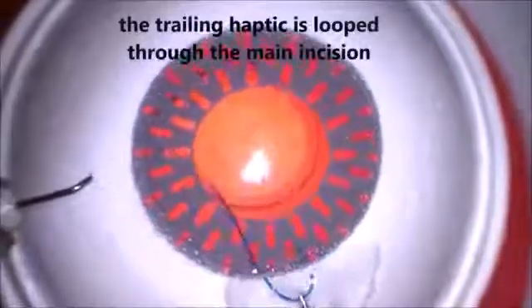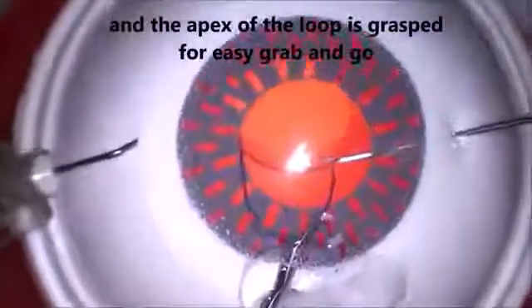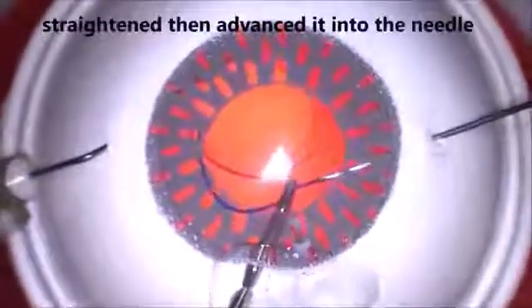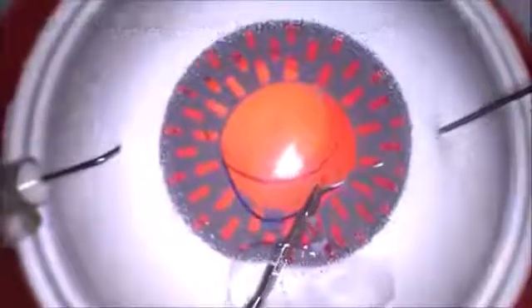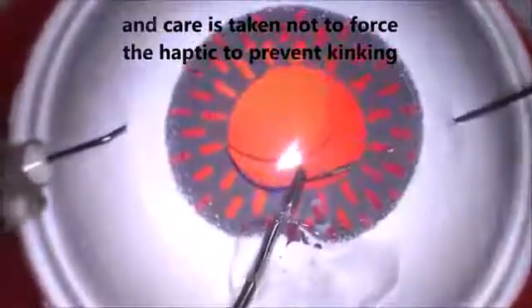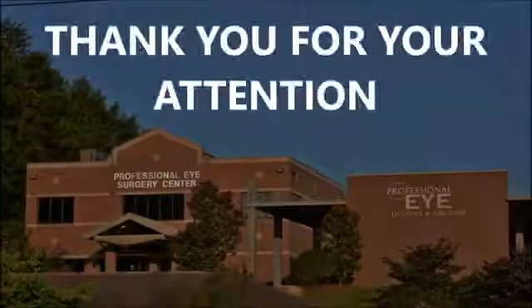I do prefer method two, which is my second modification — the trailing haptic first technique. But this is a good starting point if you want to do it the Imani way. I think using the injector to facilitate fixating the leading haptic into the left side needle is a better approach. I hope this was helpful to you, and I thank you for your attention.